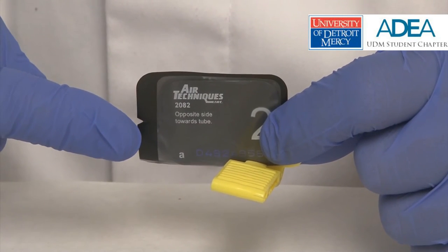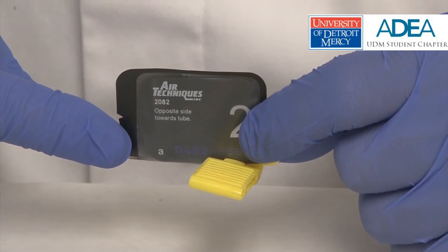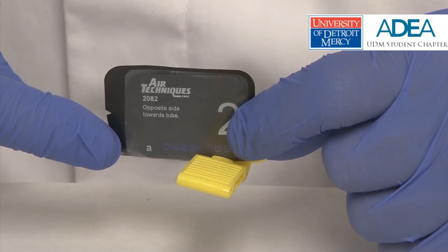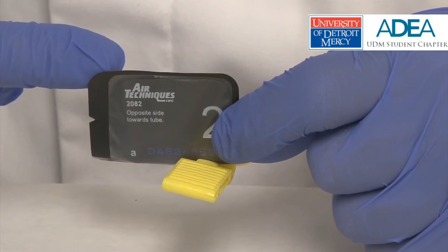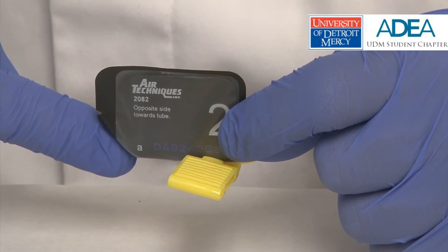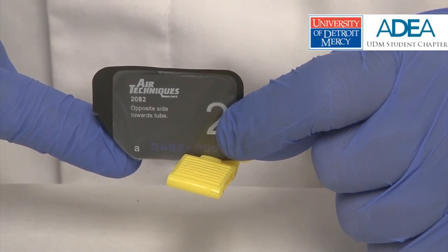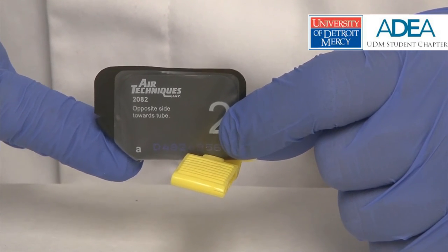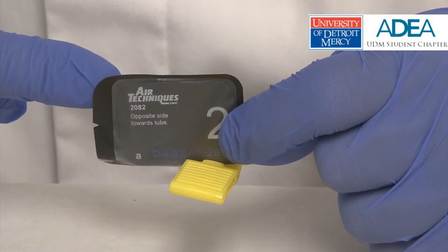Conversely, the A is placed at the occlusal, toward the bite stick, for posterior periapical imaging. In this position, the superimposed A does not interfere with the apical images of the posterior teeth. It is superimposed over the occlusal image. The interproximal of the teeth and the interproximal bone are evaluated on the bite wing X-ray. In this way, the superimposed A does not interfere with the diagnostic image of the apex of the teeth.